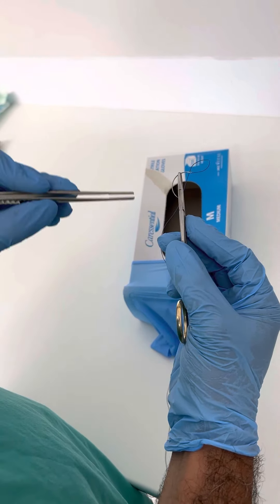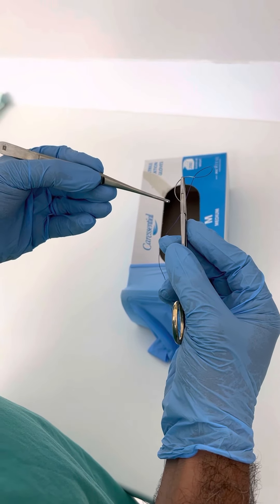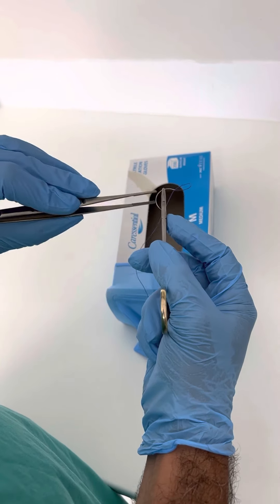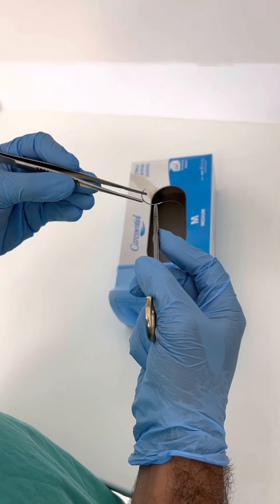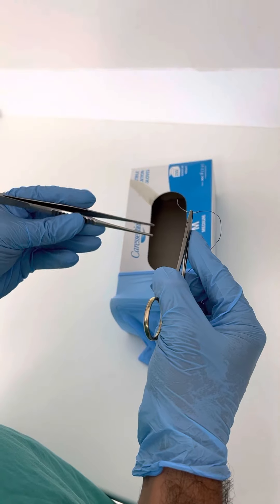You need to get into a habit of, as soon as you finish using the needle, you quickly make it safe before you proceed to the next step. You never leave the needle active because it can cause injuries to others.